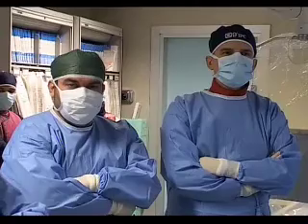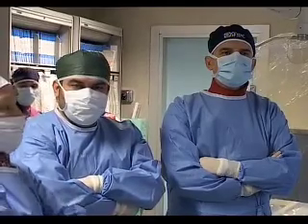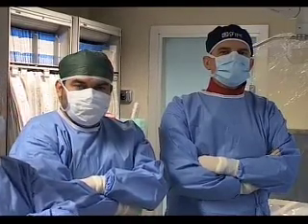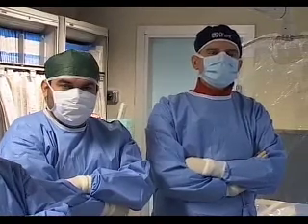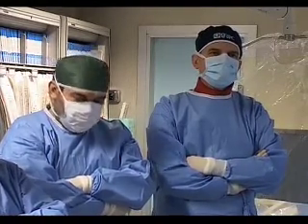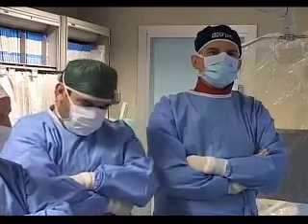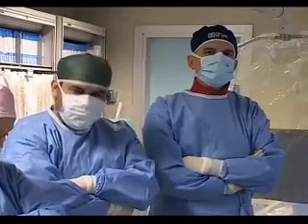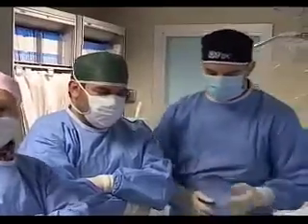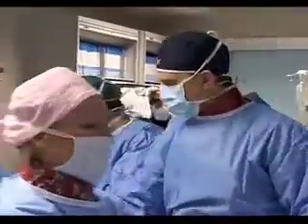I think I would put in a V12, large diameter, on a 12 millimeter balloon, 41 millimeter length. Take it up just under where the subclavian is and dilate it up that way. And then I would consider post-dilating depending on how much movement there was behind the stent. Yes, I agree. I can show you the stent if you want.